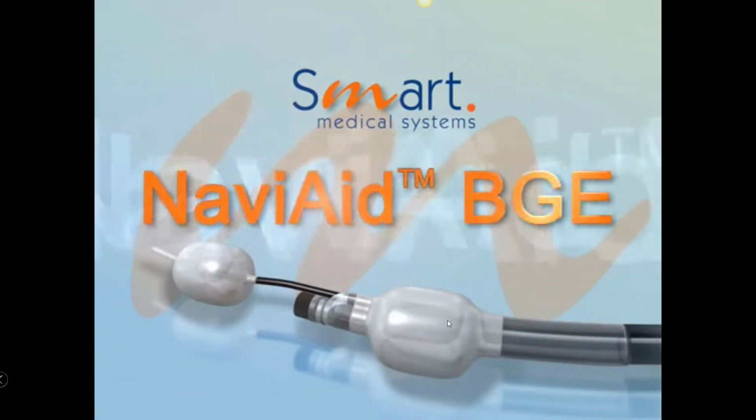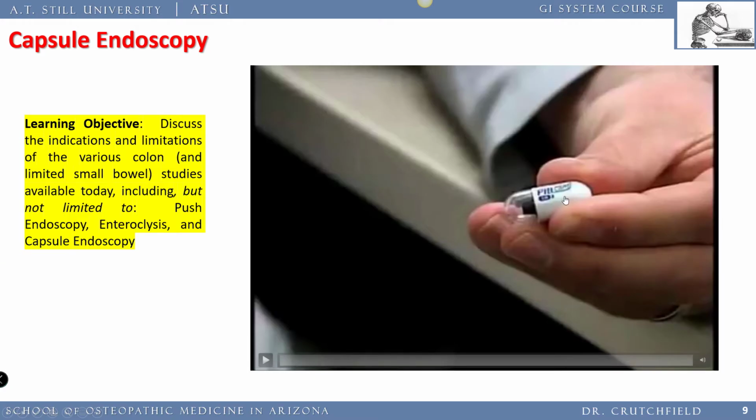Here's something called the pill cam, which is a capsule endoscope. The learning objective is to discuss some of the indications and limitations of this procedure. Well, first of all, this can get stuck distally in the small intestine. They're actually not that small.